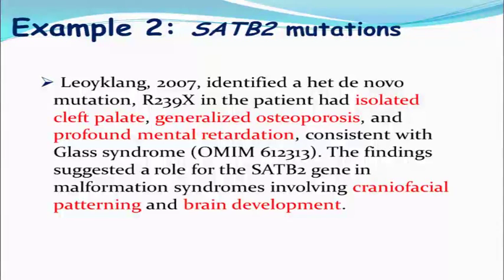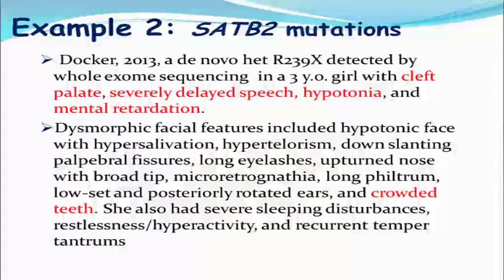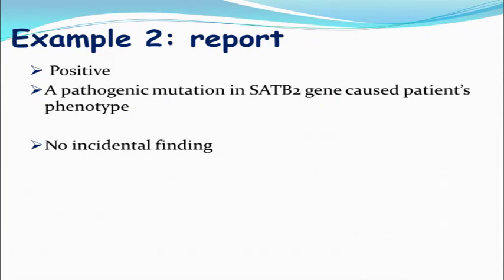So all of this fits well with our patient's phenotype. So we reported this as the pathogenic mutation causing the patient's phenotype. And in this case, we do not have an incidental finding.